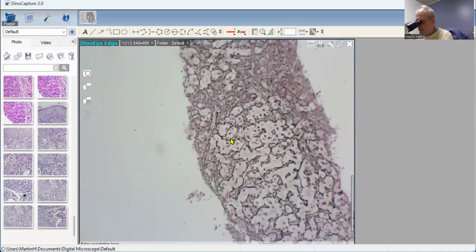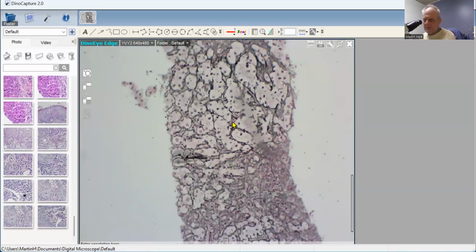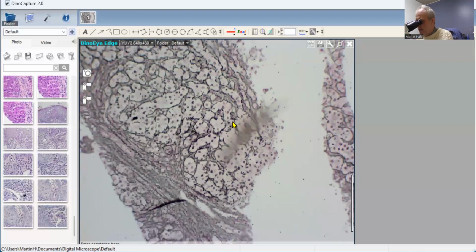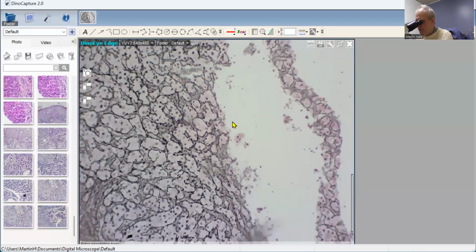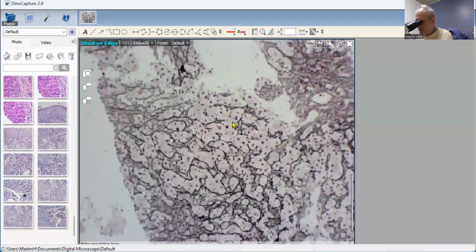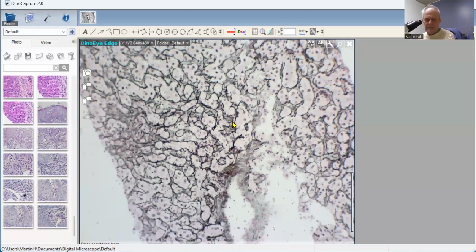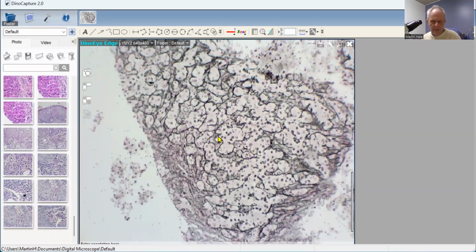We've also got some regeneration, which is happening. So this is not an acute process. But we know he's certainly got the serological features, some of them anyway, of autoimmune hepatitis. So I suppose one could ascribe the expansion of these portal tracts and the regeneration to autoimmune disease. There's another focus there of hepatocyte twinning as well.